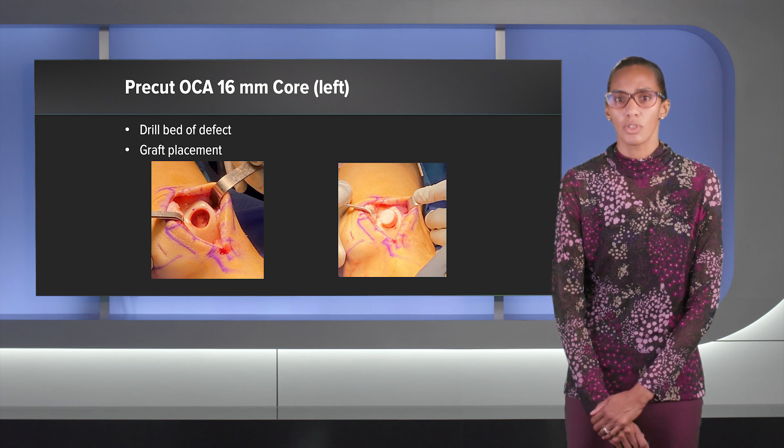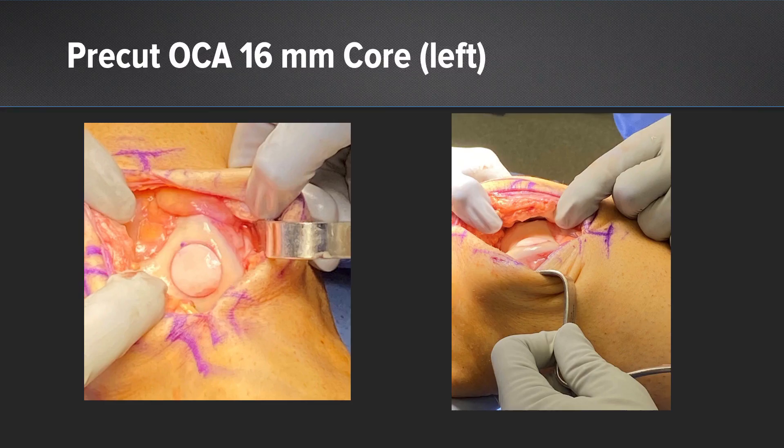For this patient on his left knee, we got a good flush graft along the lateral trochlea. The straight on view looks very nice, but really it's that lateral view where I was able to restore the curvature along the lateral trochlea. I was really happy with that fit on that graft. I didn't even have to make adjustments or take down any of the cartilage.